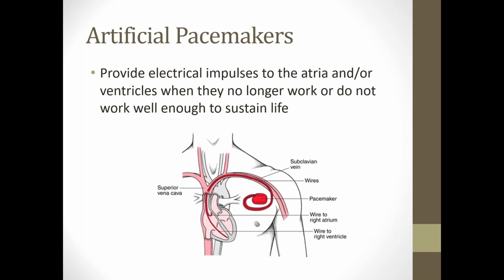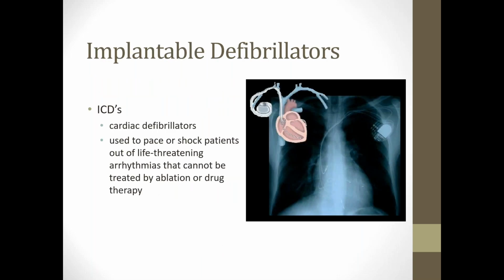After they do the ablation, they'll put in a pacemaker and connect it to the heart. The pacemaker then becomes the new SA node, AV node, or maybe both, depending on what type of arrhythmias you're getting and your needs. Another thing that they'll do in the lab will be ICDs, implantable cardiac defibrillators, and this is for people that have fatal arrhythmias that they could actually die from, so they'll put a defibrillator in there. It'll shock them back without having to immediately go to a healthcare facility.